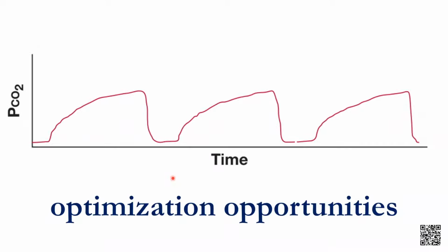And the time where I see this most commonly is we have a patient with ARDS who has a low pH. You're trying to allow some permissive hypercapnia, but you're not comfortable with the pHs, so the rate gets cranked up. We don't adjust the inspiratory time or the peak flow, and as a result, you're getting some air trapping. And sometimes the first place you'll detect this is on the end tidal waveform. I see this waveform every day I go into the ICU, at least a few times a day. It's there, it's waiting to be observed.